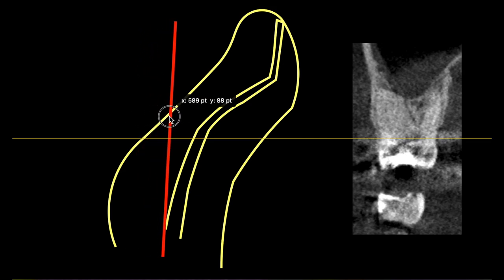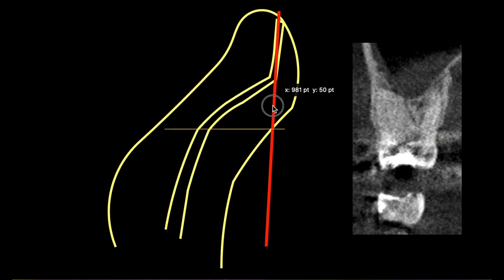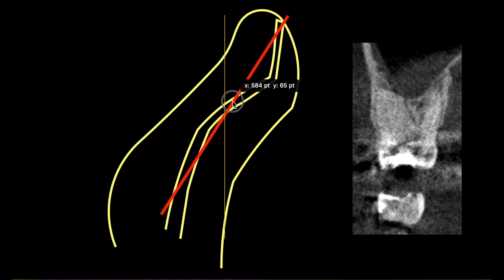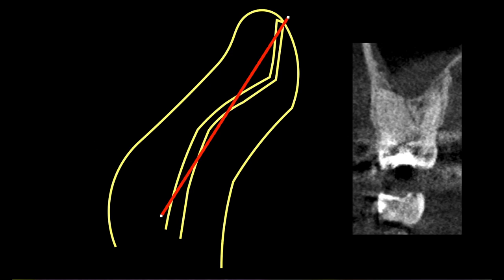The problem is as I take this, if this is our MB2 and this is one section through our coronal slice, this slice right here is what the software is able to slice through and see where that canal is. There could be a totally patent canal. The problem is I can't, as I slice through there, the individual slices don't actually get a full canal. If the canal lined up with my slice, I might get a better view, but I can't. Maybe it's just a branch off of MB1, which is totally possible.